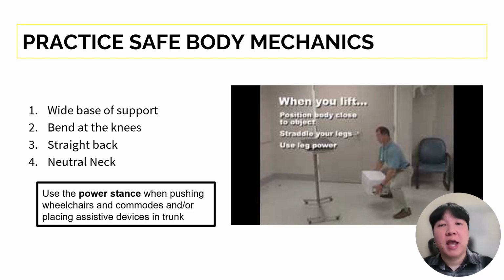These core body mechanics make up the power stance, which is especially useful when you're handling larger equipment. For example, use the power stance when you are pushing a client in a wheelchair or commode and/or placing assistive devices inside the car trunk.